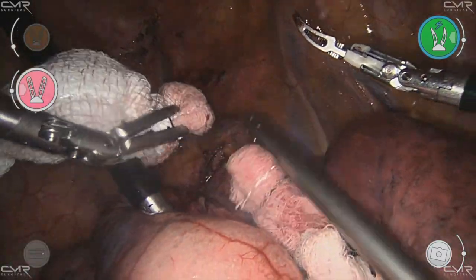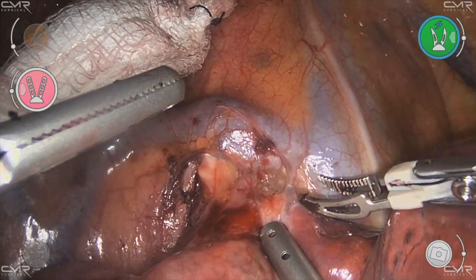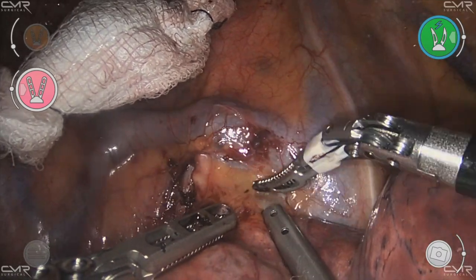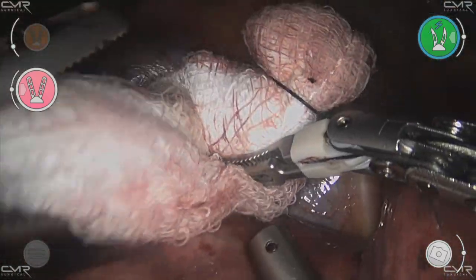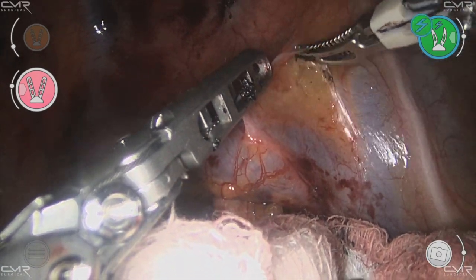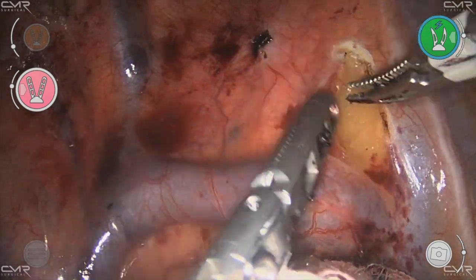These instruments are five millimeter diameter compared to eight millimeter for other robotic instruments — probably better appreciated when you hold them. Station 11 is dissected out and now we retract with the third arm, push the upper lobe down, and look at station 10, then go for station 4R. This is a really important part of a right upper lobectomy — dissecting between the truncal branch of the PA and the right main bronchus. It's also important to get station 11 and station 10 lymph nodes out and dissected from under the azygous before going over the azygous to do a complete lymphadenectomy. Dissected under the azygous and now going over the azygous.